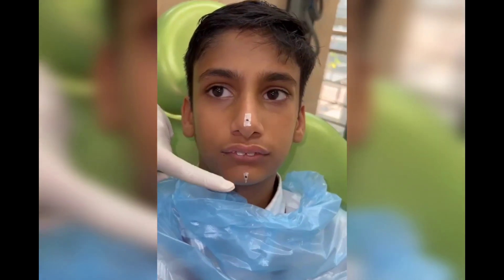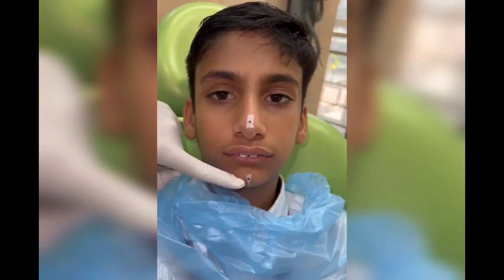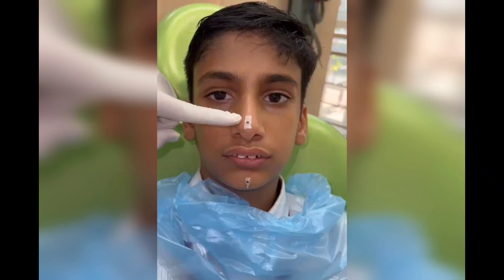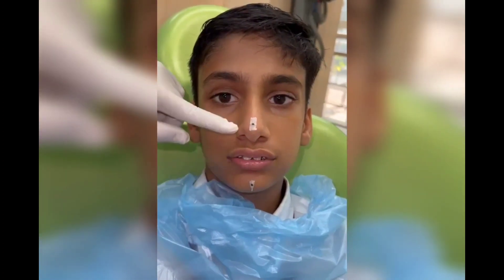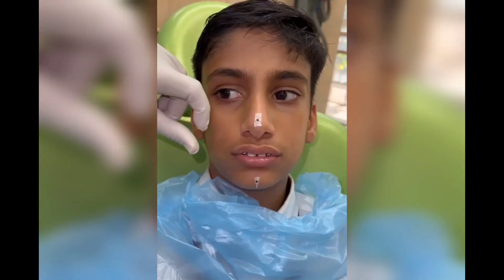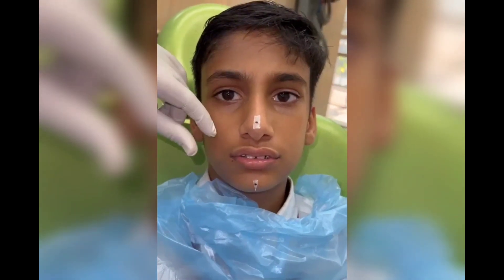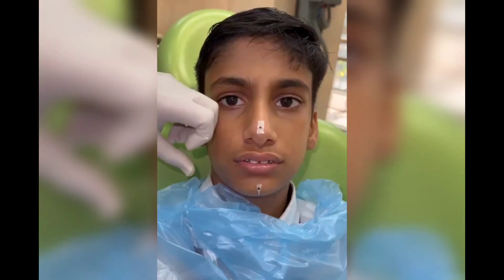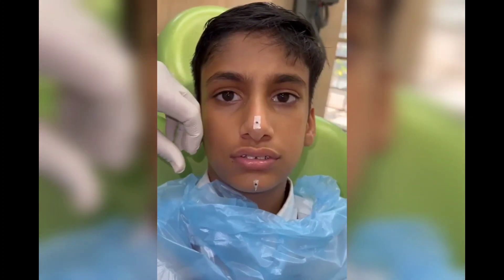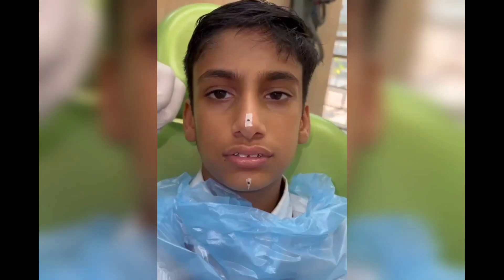We have placed two marks on the patient's face so that we can record the vertical relation at rest and vertical relation at occlusion. Ideally, the height of the bite should be more than the freeway space so that the appliance fits well at night when the patient is sleeping and the jaws fall apart.